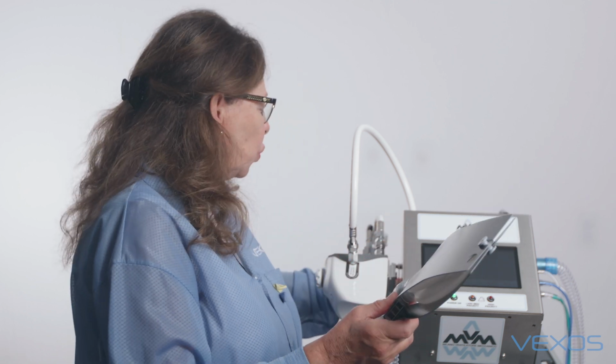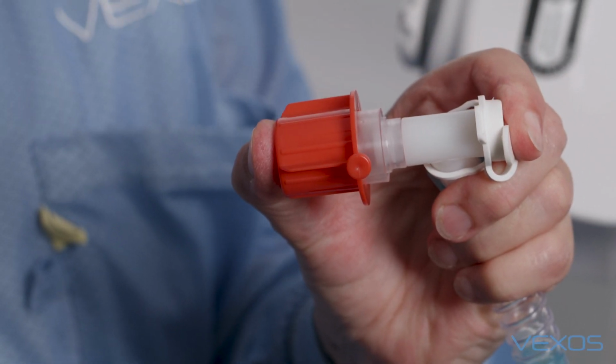The first test is the obstruction test. By that, I'm going to remove the test lung and block the tubing. I'm going to use a cap for that purpose, and we should get an obstruction alarm. So I'm going to remove it. I'm going to cap it, and we should get an obstruction alarm.